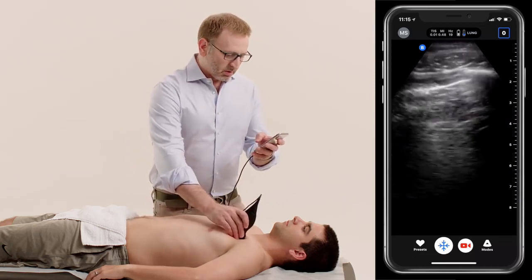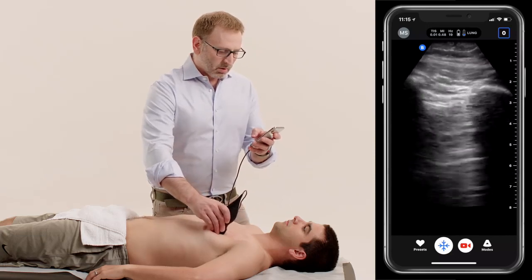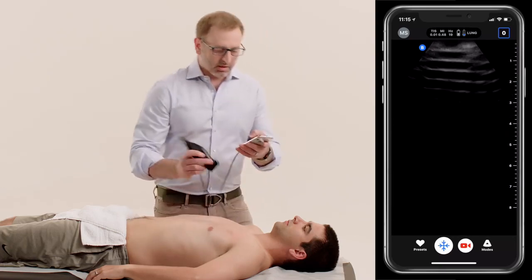moving on to the left, identifying lung sliding on the left, and that's the extended FAST exam using the IQ.